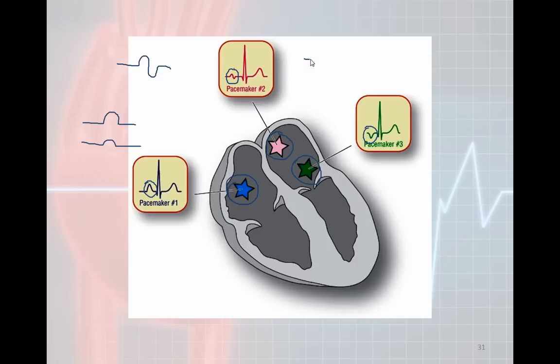You could also have one that's biphasic with a terminal hump, and you could also have one here that's inverted like this. You could also have an ectopic atrial which causes it to do something like this or whatever. So the point is that there are three clearly different P waves to find a wandering atrial pacer.